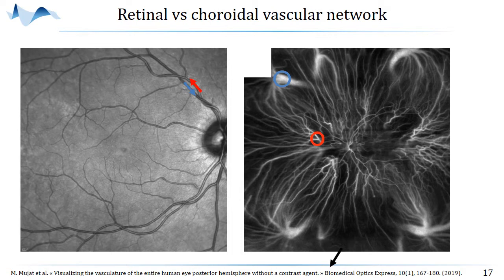So unlike the retina, if you take a side-by-side artery and vein, blood flow will run in the same direction, and this time you will have in the central region arteries being very large, carrying a lot of flow, and veins that just start to accumulate a little bit of flow and that are very small. So that is the reason why they have different velocities in the central region.